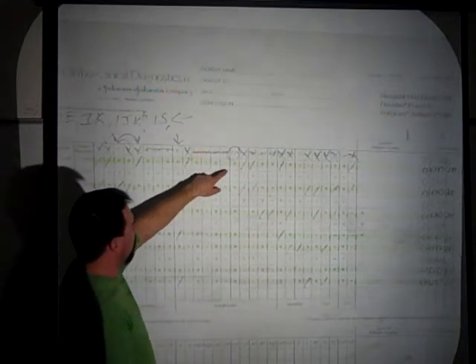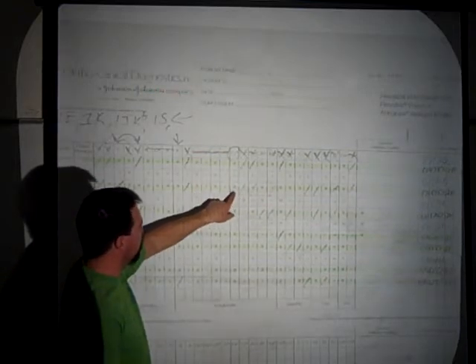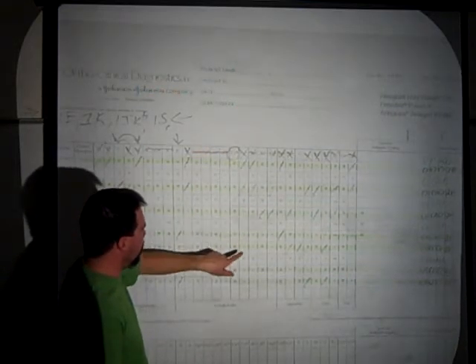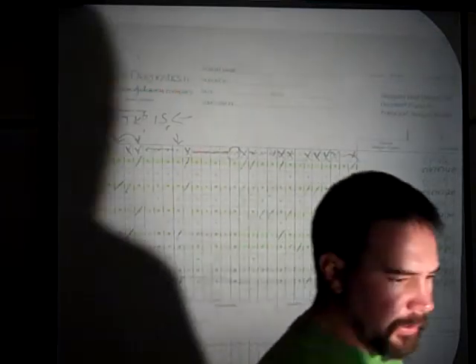And what I mean by look at the pattern of reactivity, who's positive reacting in positive cell lines and who's negative in negative cell lines. And we'll cut to the chase. Let's look at Duffy A. It's negative reacting on a negative cell line, positive on a positive reacting cell, negative, positive, negative, positive, negative, negative, positive, negative, negative. So that really gives me a good gut indicator that Duffy A is most likely the antibody involved in this patient's positive antibody screen.